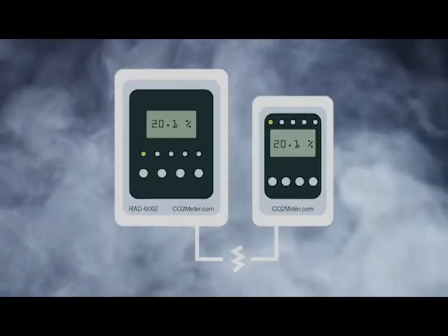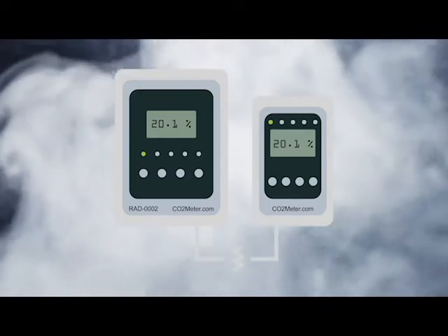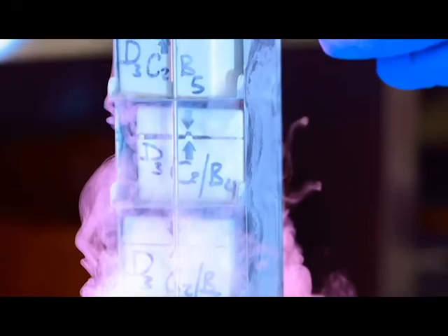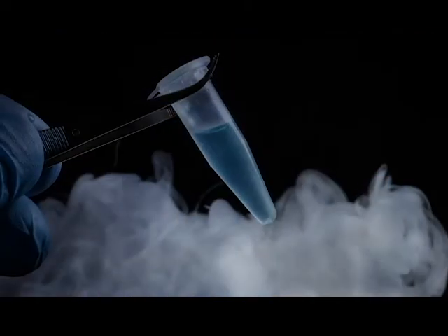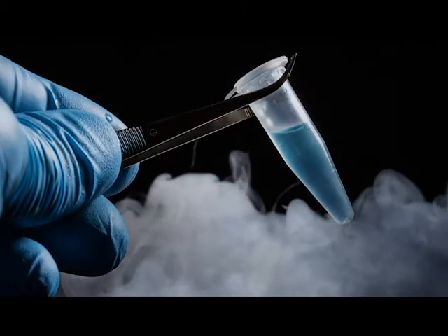Hello, in this video we will show you how to install your RAD0002 remote oxygen depletion safety alarm. The RAD0002 is ideal for facilities that use bulk inert gases — helium, argon, nitrogen, etc. — such as cryogenic labs, medical facilities, and much more. Pressurized system gas leaks can very quickly displace oxygen and result in an oxygen deficient area.